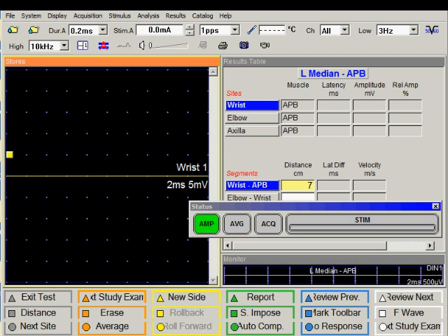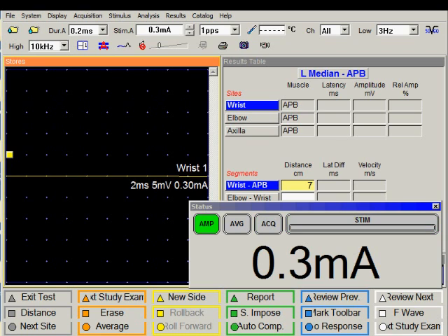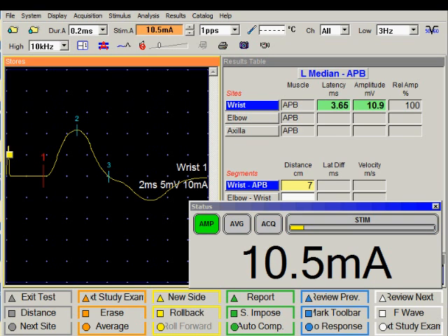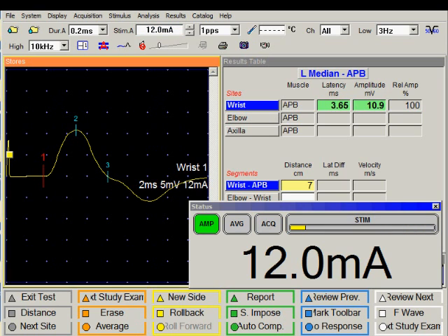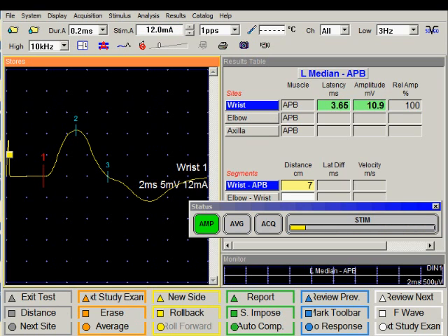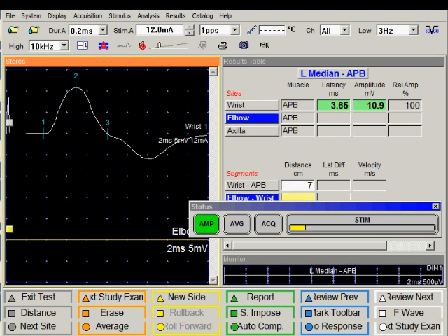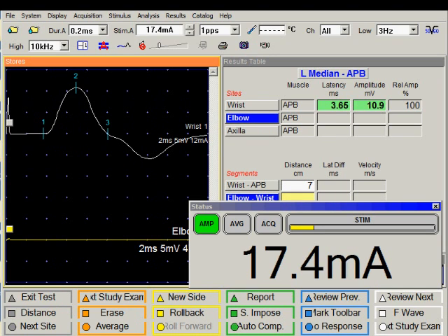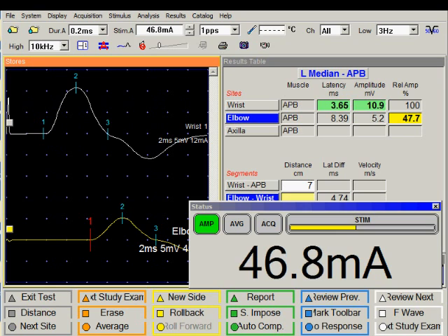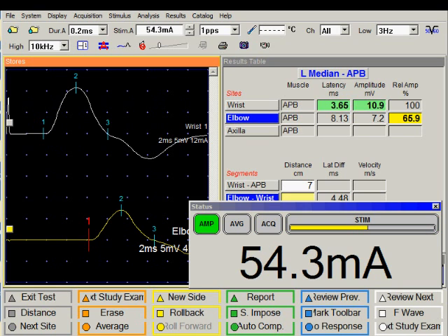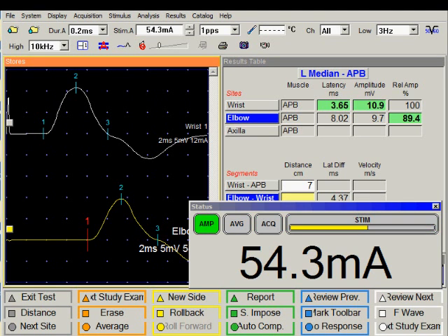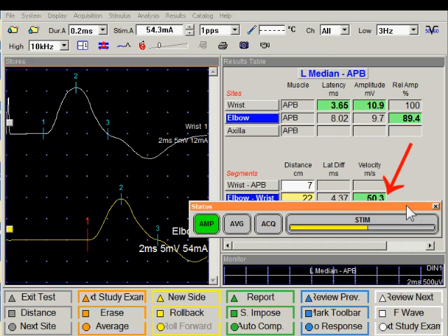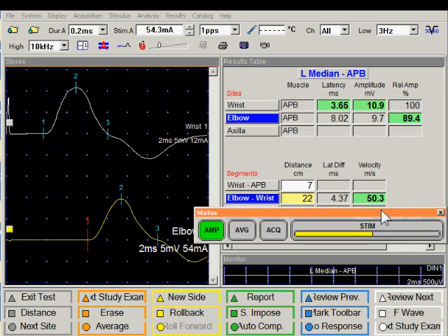Let us perform the recording. We have a nice response over here. I will save this. I will advance to the next site. Stimulate proximally. Input the distance. And I have my conduction velocity. I have finished my median motor nerve conduction study.